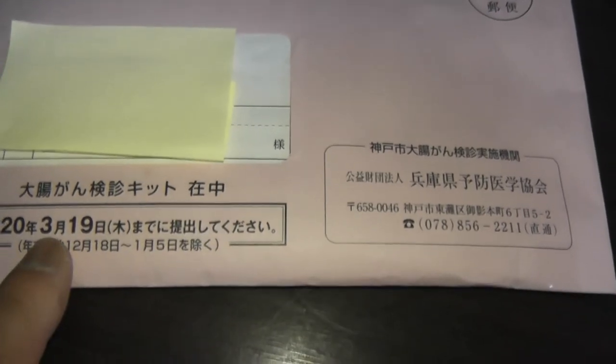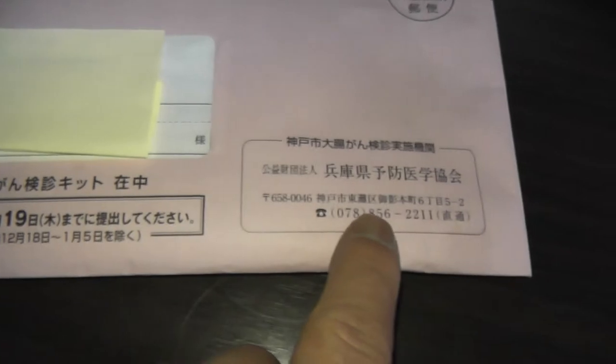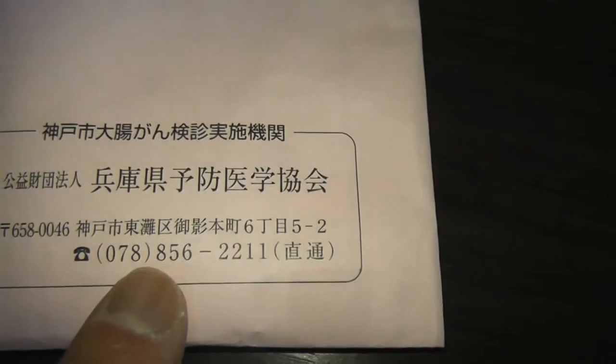Anyone who lives in Japan and who is at least 40 years old can apply for this. It costs 500 yen. It's a do-it-yourself kit. It's already the third week of February — I have until March 19th to submit it.